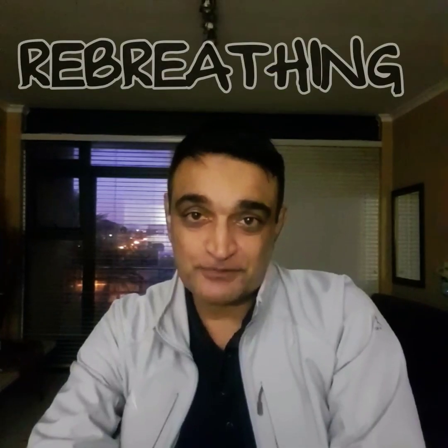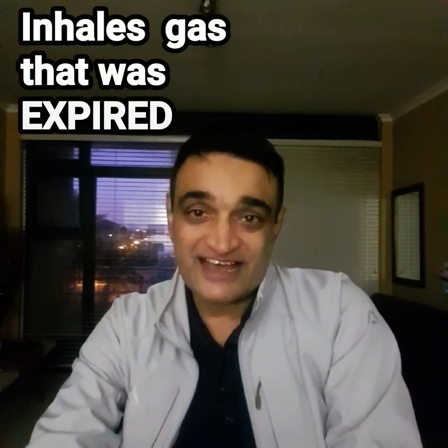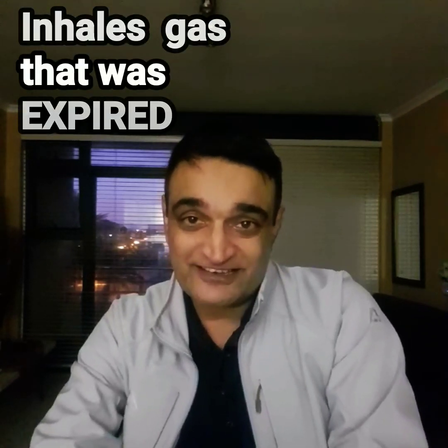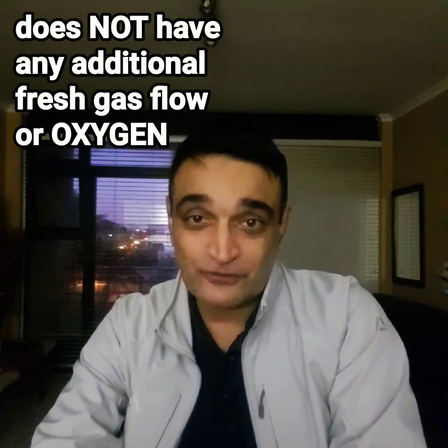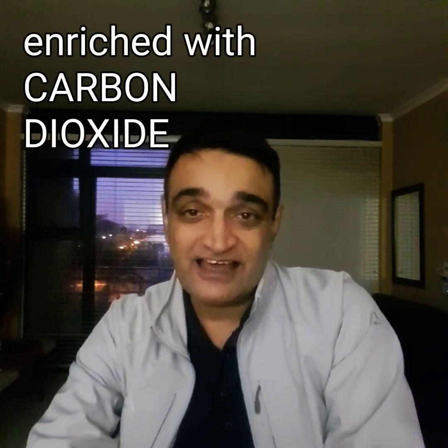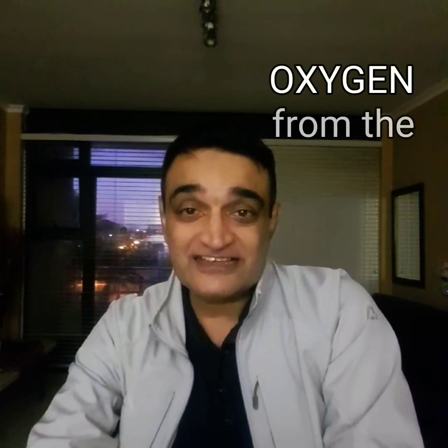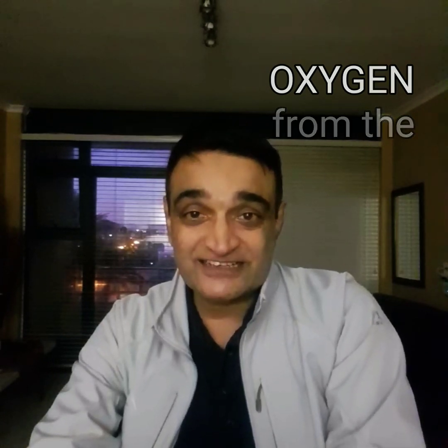of discussion is rebreathing. Rebreathing is an occurrence whereby the patient inhales gas that was expired, and that gas does not have any additional fresh gas flow or oxygen and is enriched with carbon dioxide. And because of that, there is washout of oxygen from the lungs. And when that occurs, the levels of oxygen in the lungs decrease dramatically.